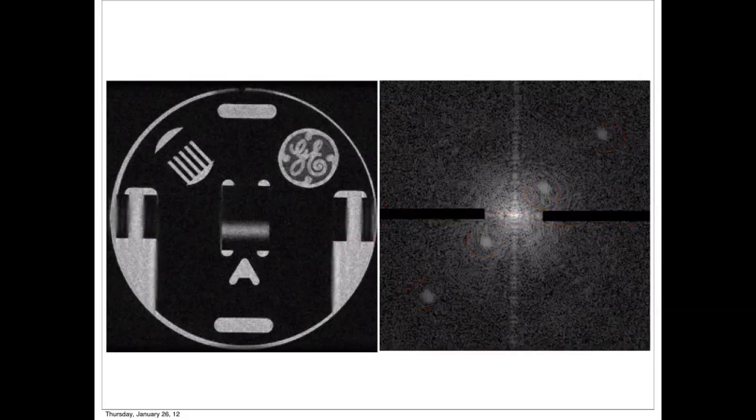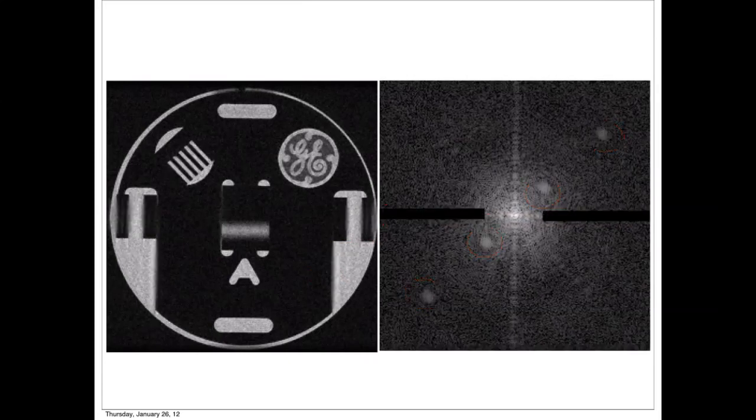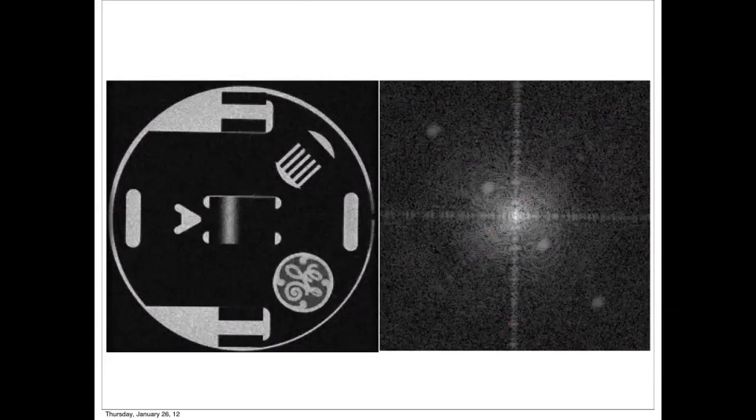And if I delete this, like here, you could see how those edges are becoming smooth. Do you see? If I delete that, let's go back and forth. Cool, huh? And if I delete this edge, this part, let's see if I delete it. No, I didn't. Okay, I didn't show it.